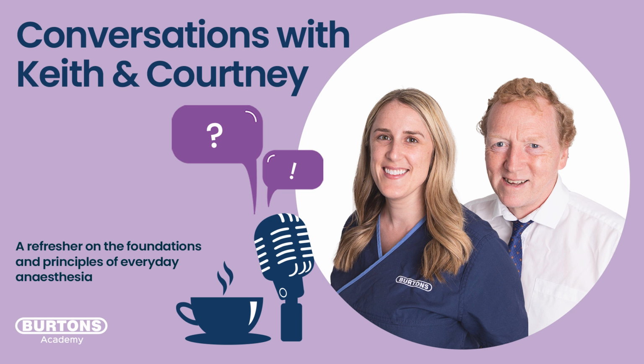I think last night, when we had a little catch up to talk about the weekend, we also got into our nerdy wormhole and said basically that by the time you see a reading on your pulse ox, it's actually quite a delayed reading. It's not that a breath happens and then suddenly it falls really low. The reading on our pulse ox is actually quite delayed because it's placed on the periphery. So it's got to be something that happened in that patient's lungs, or didn't happen, about 20 or so seconds prior.